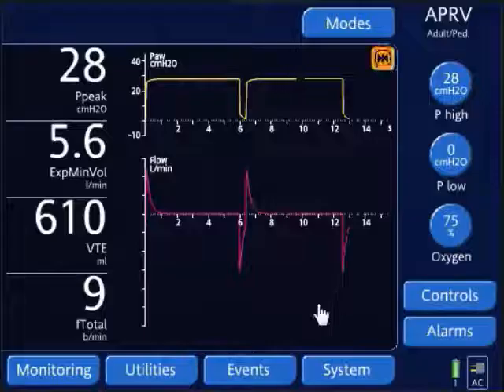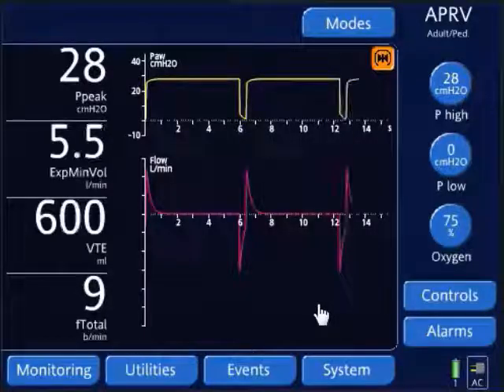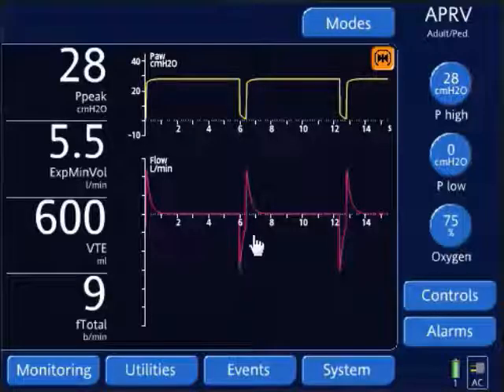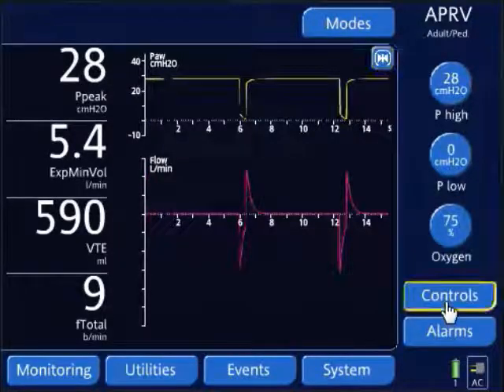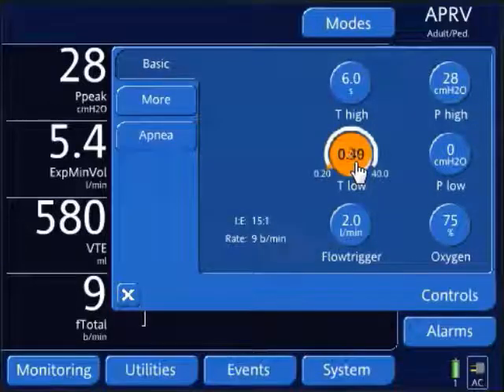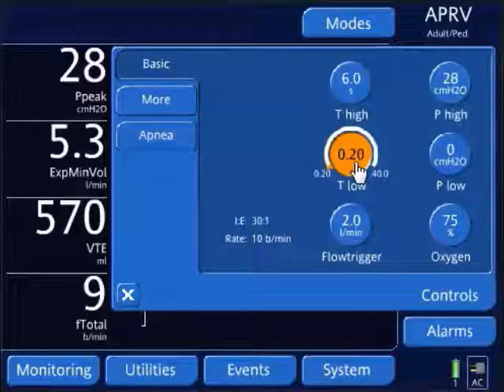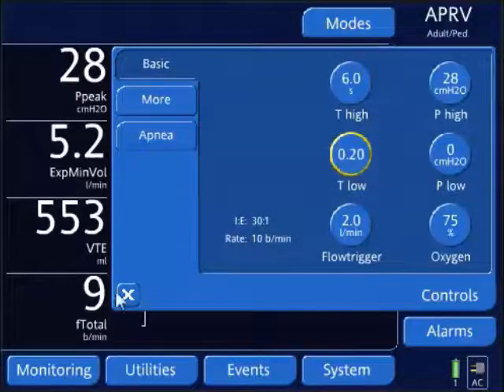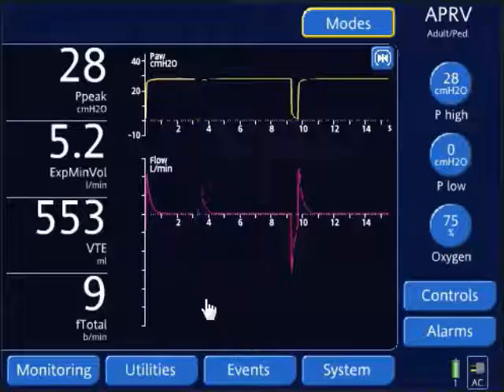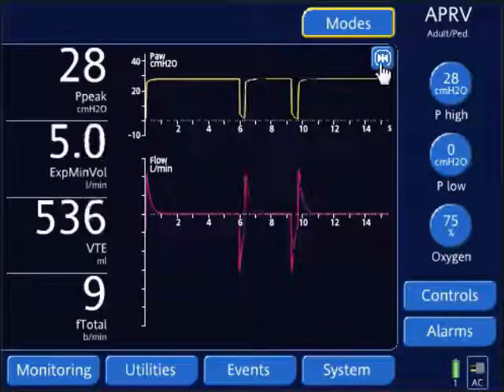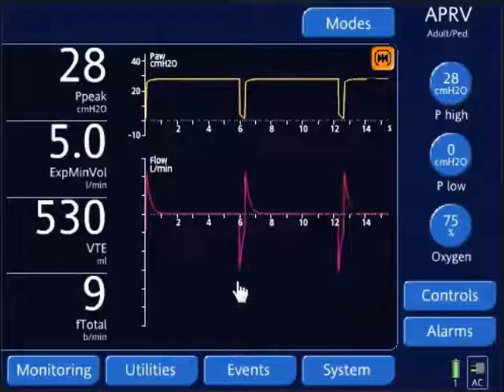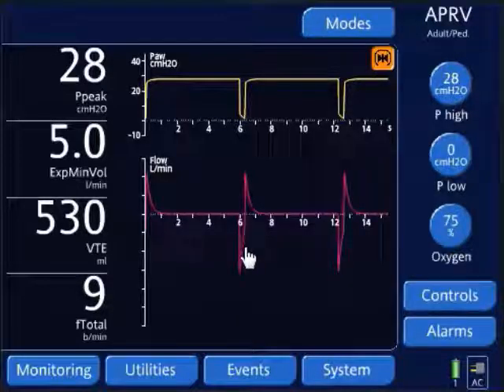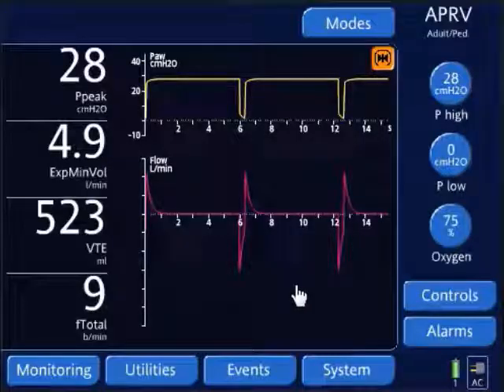I'm going to freeze my screen to reassess the expiratory flow waveform. Here's my peak expiratory flow and here's my termination point — we're getting there. I'll decrease my T-low a little more. You always want to do this in small steps and reassess the waveforms to make sure you don't go too extreme above 75%. Evaluating our peak expiratory flow and termination point, we're now above 50% — we're in the golden zone.